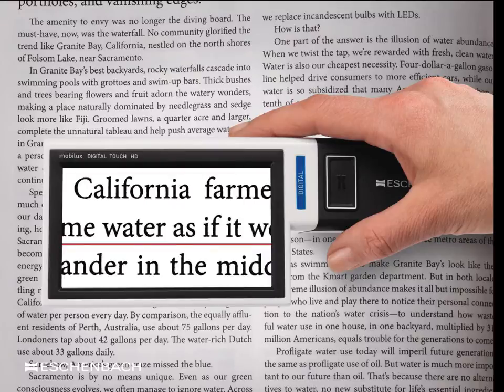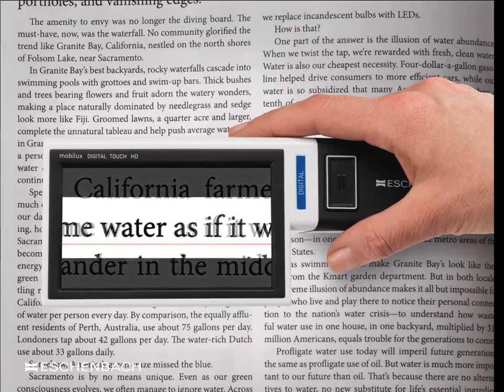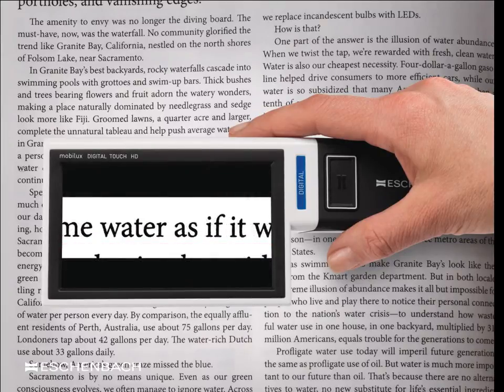One of the most common complaints from patients when using high levels of magnification when reading is navigation — when patients struggle to find the beginning of the next line. In the MobiLux Digital Touch HD, a reading line may be introduced, which many users find useful to assist with this problem. Another feature that assists in navigation is the option to isolate a single line from the rest of the text, which also improves reading performance in a similar way to using reverse contrast print.